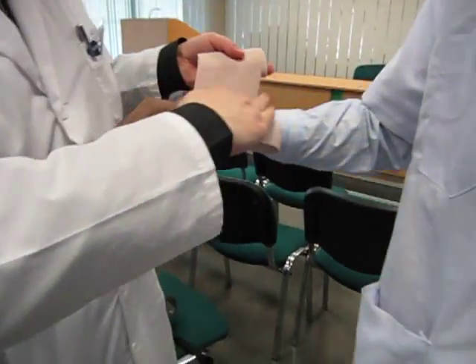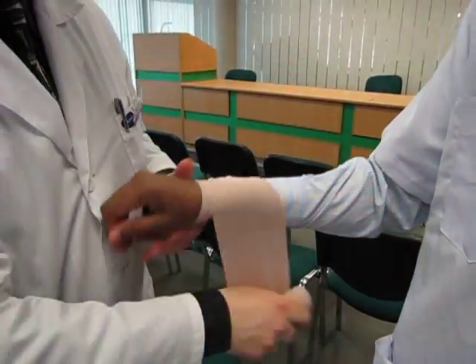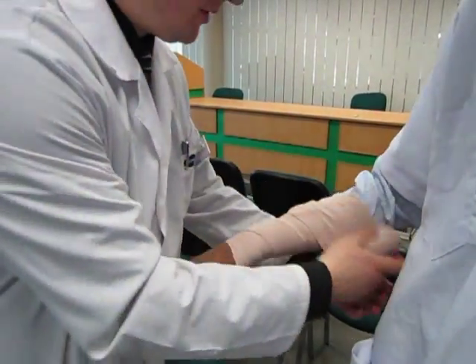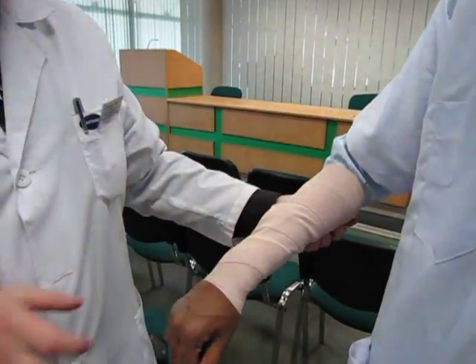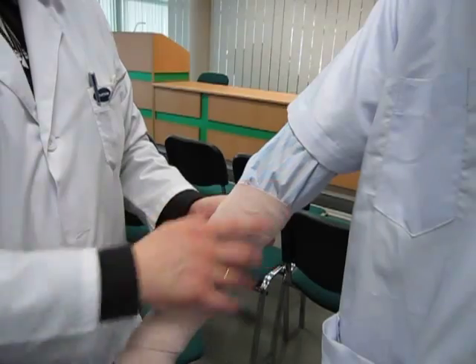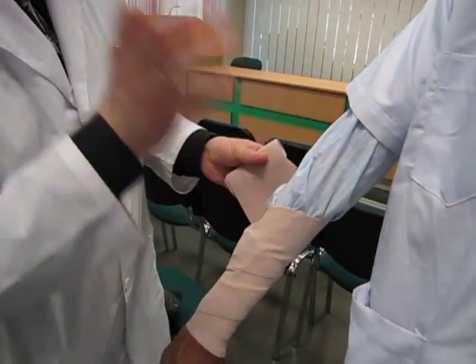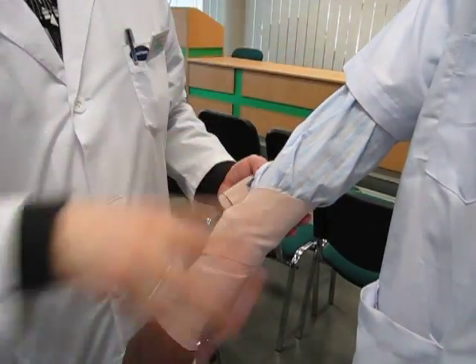Only after that we can fix the bandage, and after that we can cover all the forearm. From the thin area to the wide area — this is the next rule. We should form our bandage to cover all the skin surface from the thin end to the wide zone.